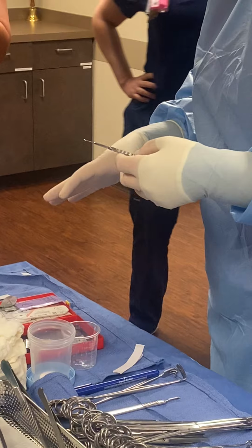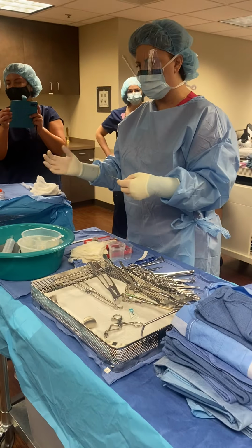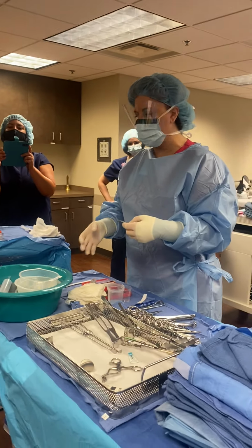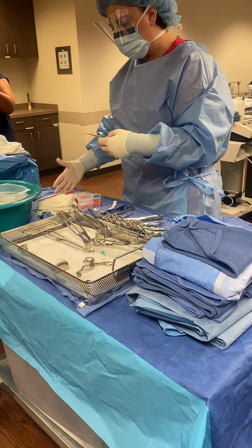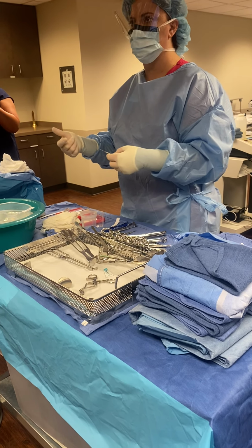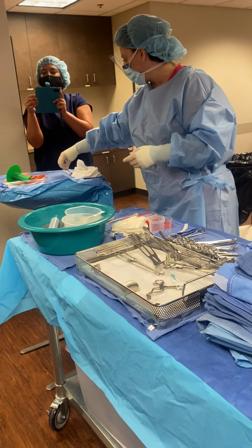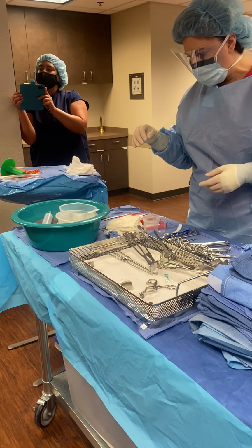There are a couple of different things you can do. If the facility uses a hands-free or sharps passing policy, you can put it in your kidney basin. You can keep it on the back table until it's time, but if they're going to use a knife and the local right off the bat, I typically just put it up on the mayo stand. I like to keep my sharps closest to me.